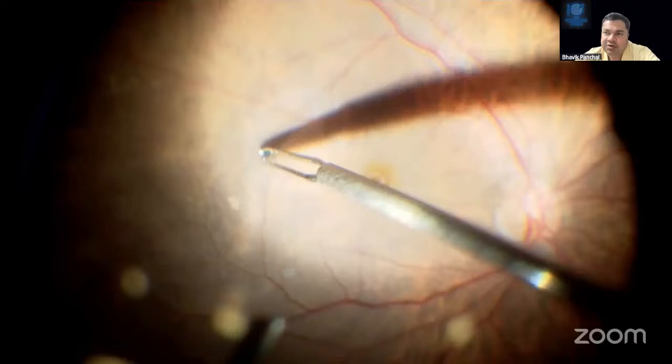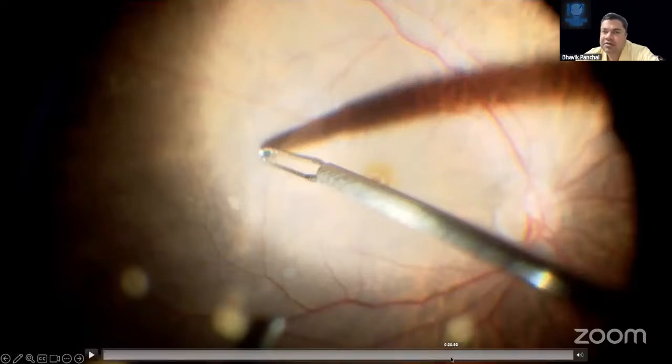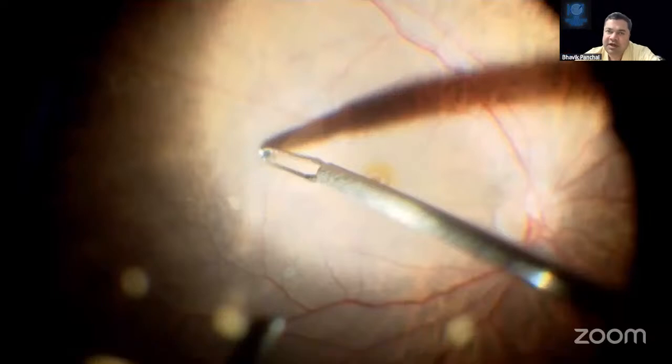So I'm sure all the surgeons here are experienced with their use of BBG, but especially for a beginner, inject outside. There should not be any air, and once you go in, try to inject on a safer part of the retina.